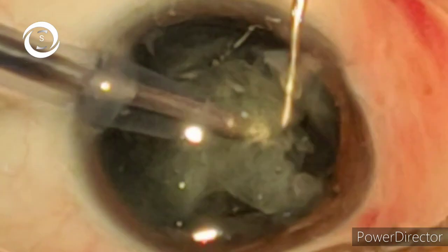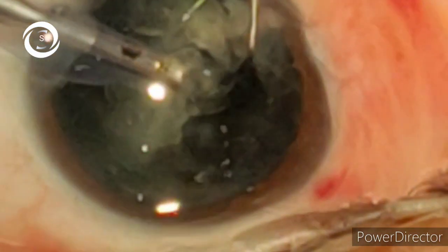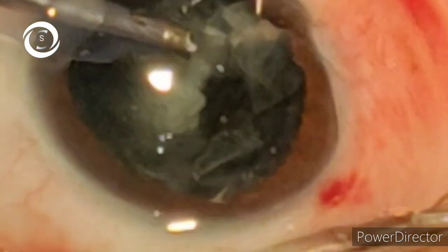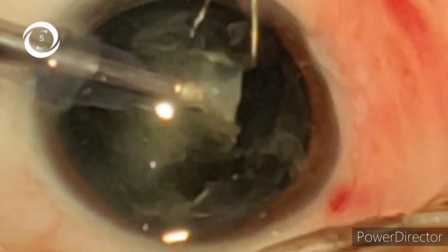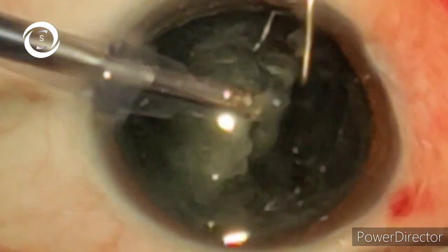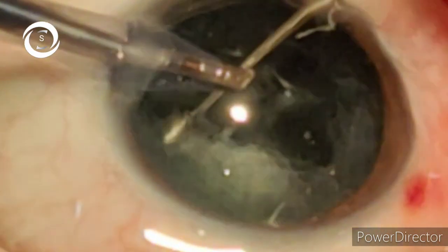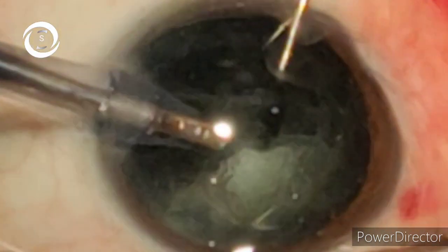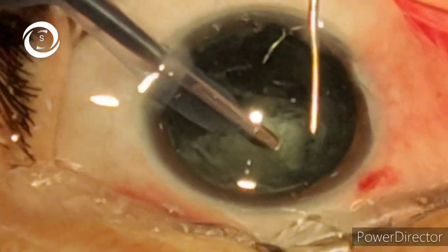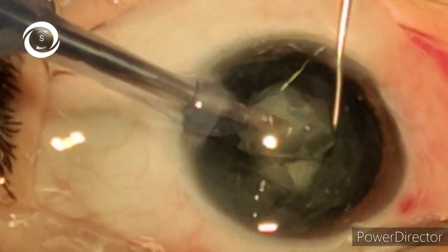Once it is divided into two pieces, the rest is easy. You can divide it into many pieces, and in this division technique chances of PCR are almost zero. Engage the divided nucleus with the phaco probe and chop it with the second instrument. You can see how quickly and easily half of the nucleus is emulsified. Rotate the remaining piece, engage it, divide it, and emulsify.